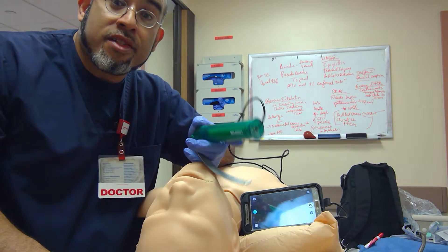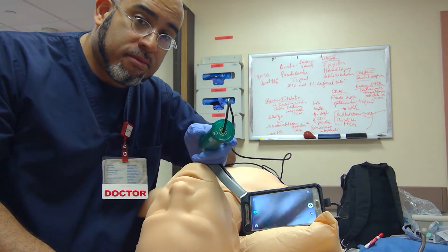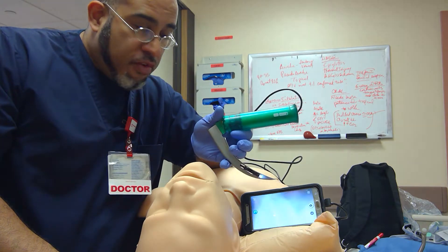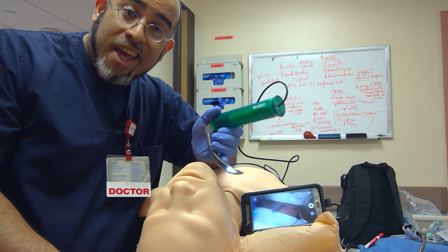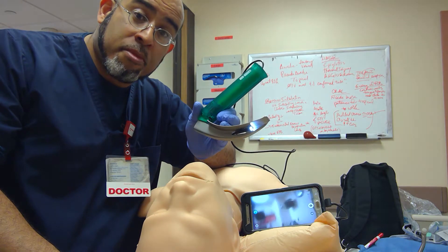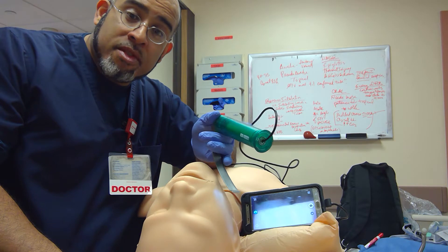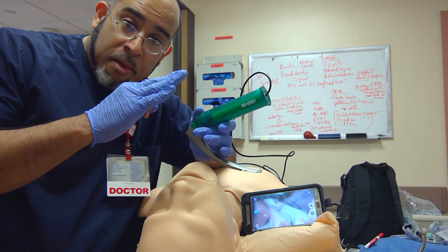Get an audience to witness your success — first pass success by direct visualization. Hopefully technologies like this will be incorporated more often in teaching institutions and non-teaching institutions to verify the safety of your intubation. First pass success will be witnessed by more than just your eyes. Any comments are welcome. This is School of Airway — bye bye.